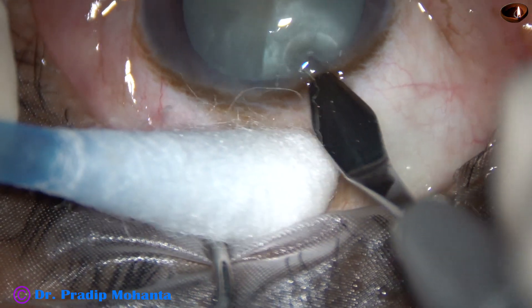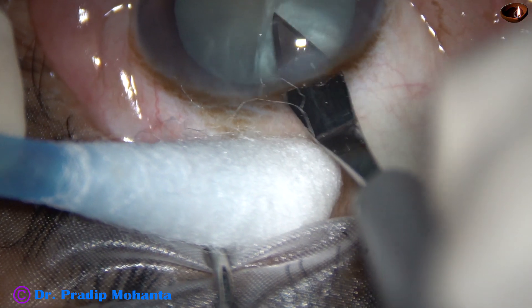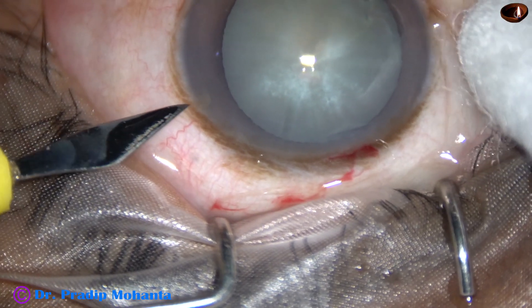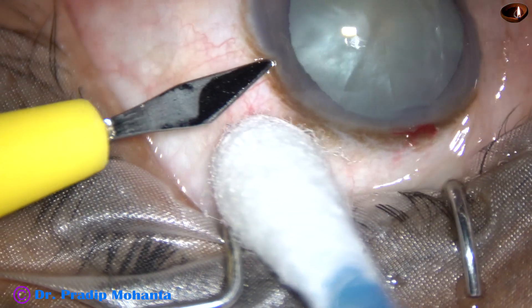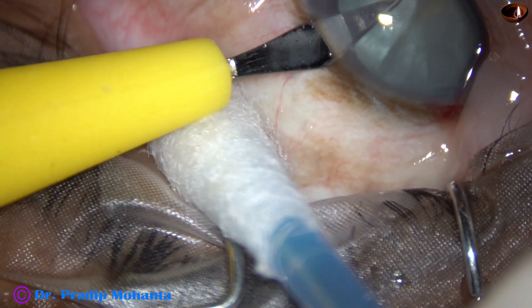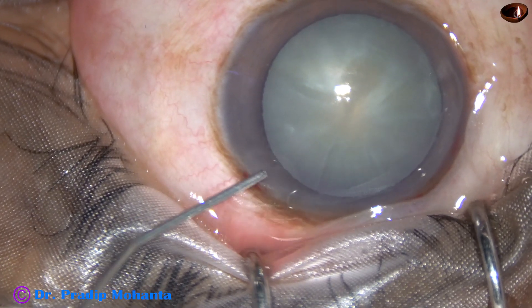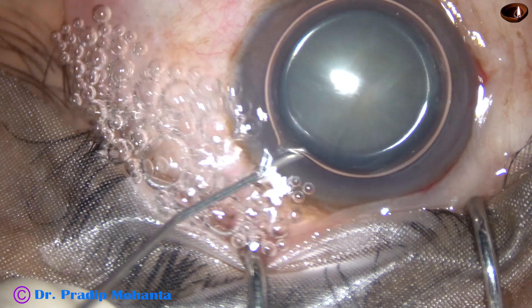This is the main incision at around 11:30 o'clock with a 2.8mm steel keratome at the posterior aspect of the limbus. This is our side port on the left side of the main incision, about 3 clock hours away. In this case, I need only one side port.